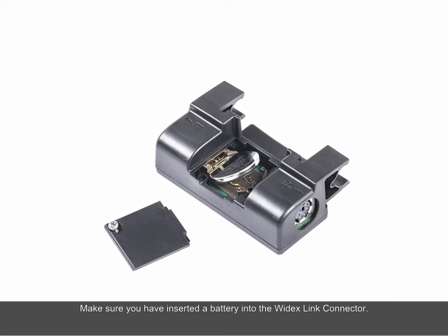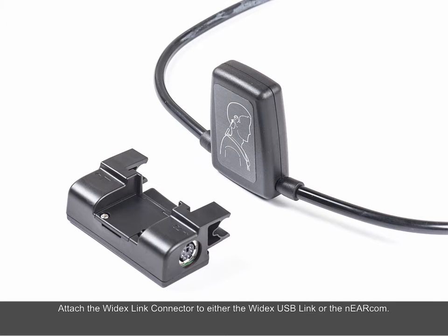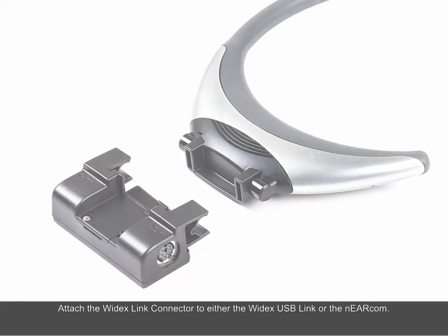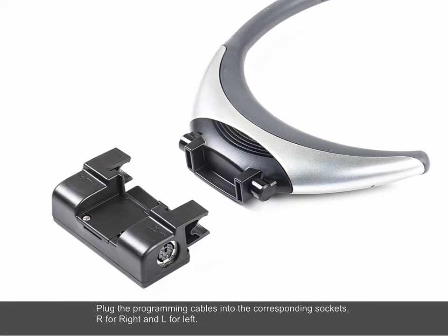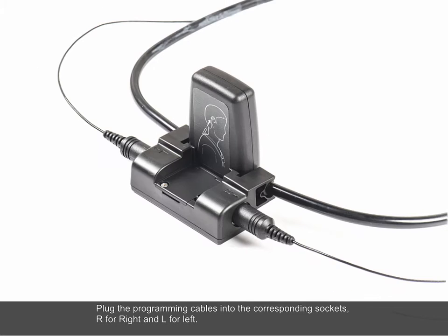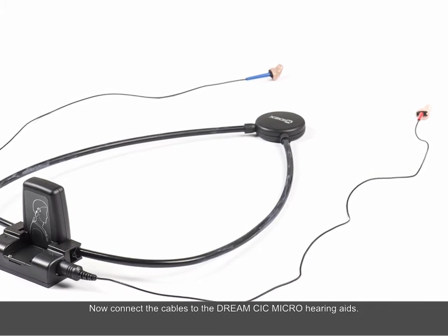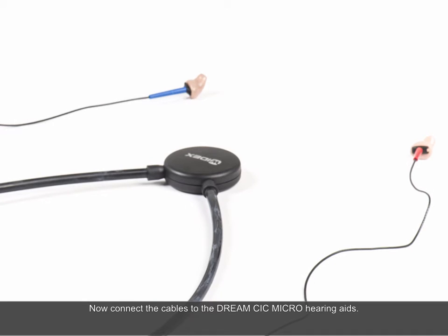Make sure you have inserted a battery into the Widex Link Connector. Attach the Widex Link Connector to either the Widex USB Link or the Nearcom. Plug the programming cables into the corresponding sockets — R for right and L for left — using the standard Widex CIC cables. Now connect the cables to the Dream CIC Micro hearing aids.